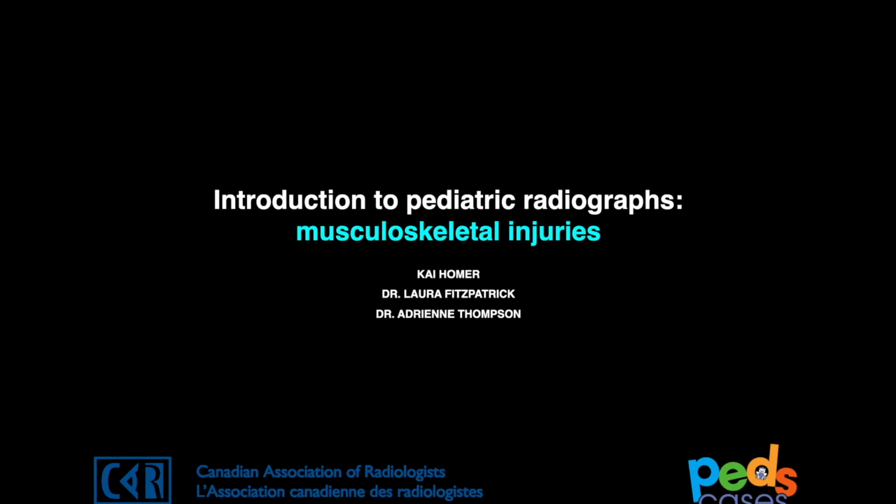Hi, my name is Dr. Kai Homer, and I'm a resident in radiology at the University of Alberta. This video is the third in a series discussing musculoskeletal radiology in children. We're going to focus on musculoskeletal injuries and go through some cases to help you understand how radiology fits into the whole clinical picture. In this video, we'll review our approach to pediatric shoulder radiographs.